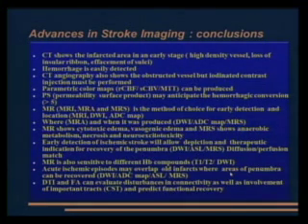So CT showed the infarcted area in an early stage. Let's see, in 24 hours. No, the MR is the fastest. It's 20 minutes after the start of the occlusion. And I think that's it.